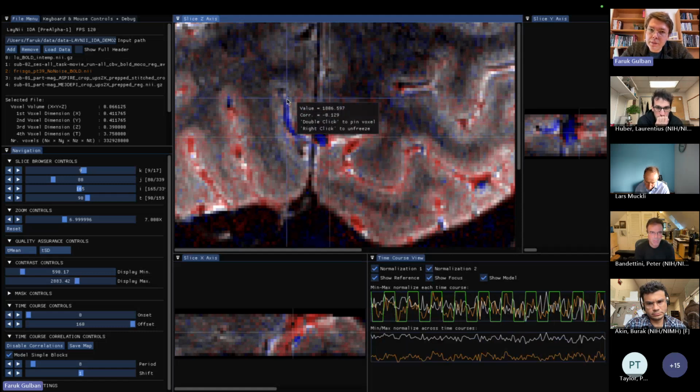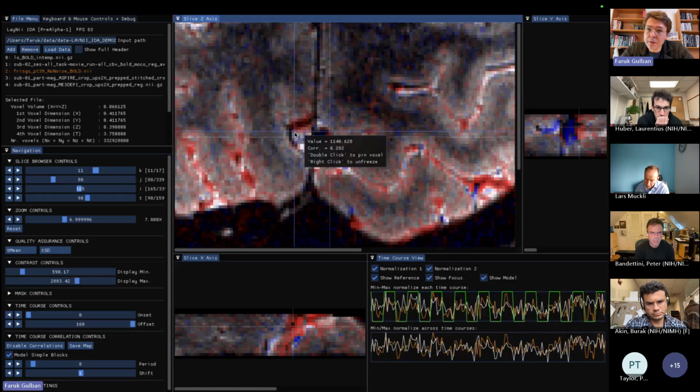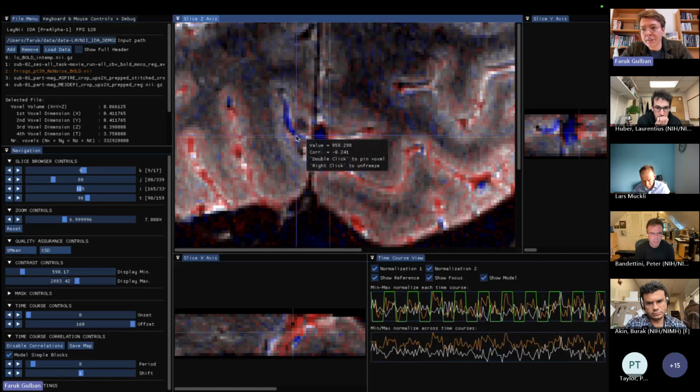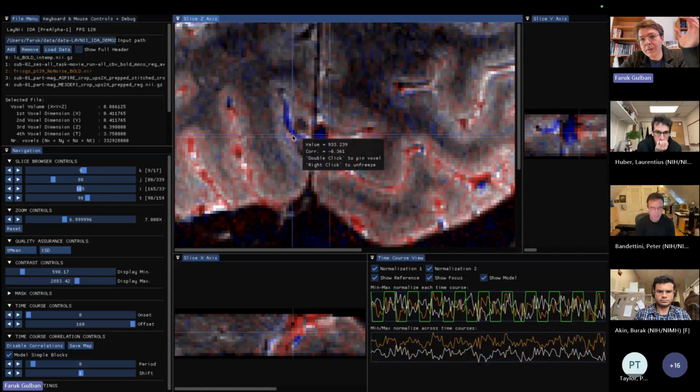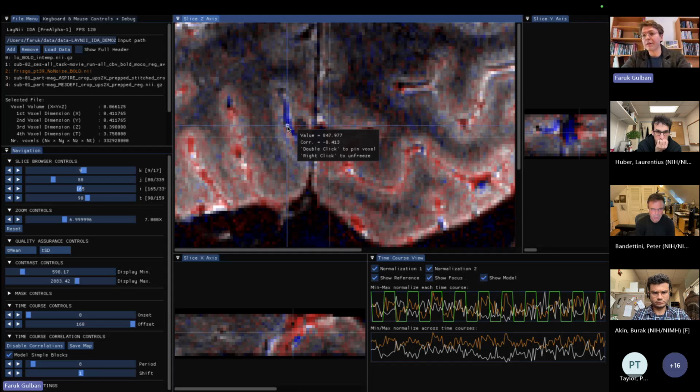And look here, there is this negatively correlated arm, which I suspect is actually an artery, based on what I explained like 5 minutes ago. So this is an artery. There is enough blood motion artifact in it so that it looks like just a dark hole. It is vasodilating together with the activity, and when there's activity, it creates this increase of the dark values through partial voluming.